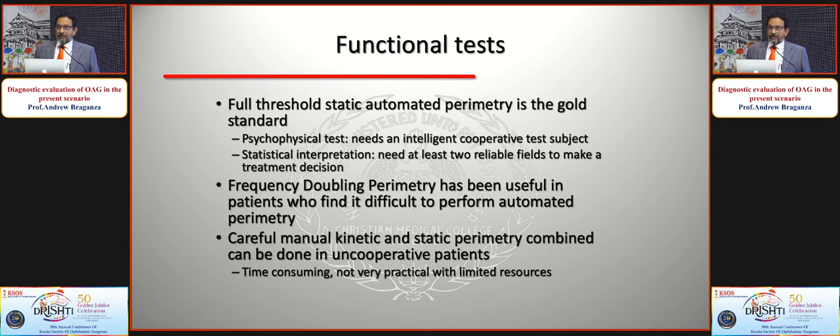FDT has been used. It's a slightly different modality. And in children and patients who are unable to perform automated perimetry, it can help in the diagnosis. When you can't do any of this, then you do careful combined manual static and kinetic perimetry. And again, very time consuming and resource consuming.